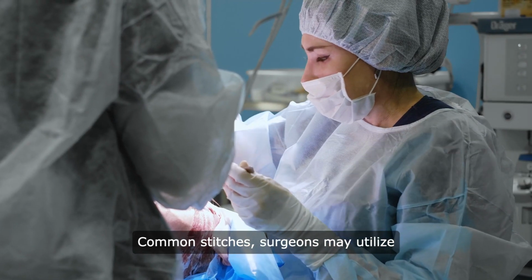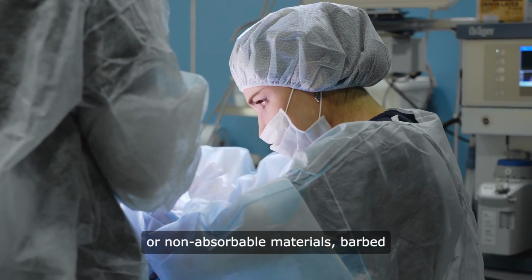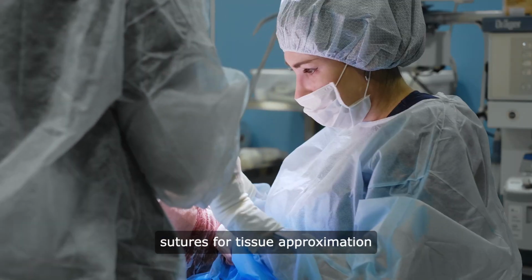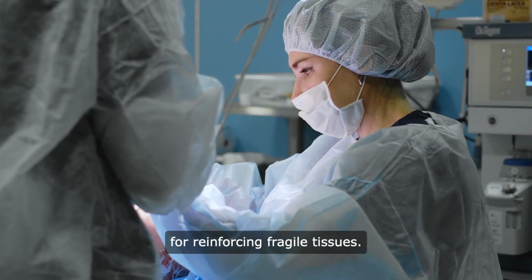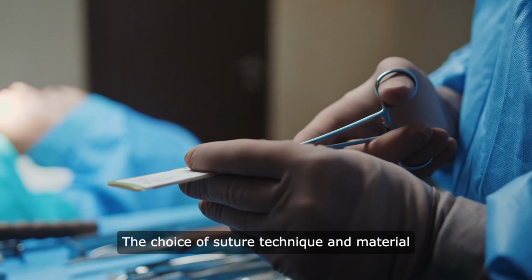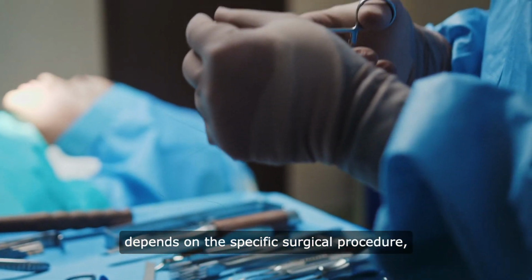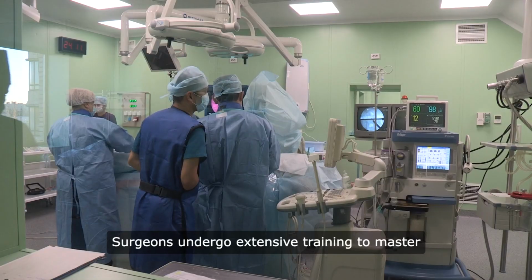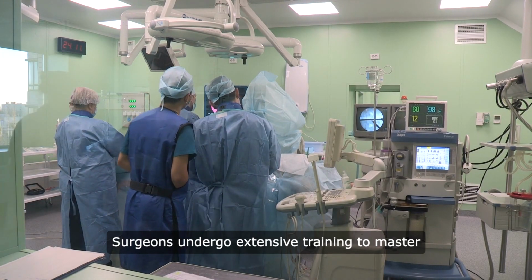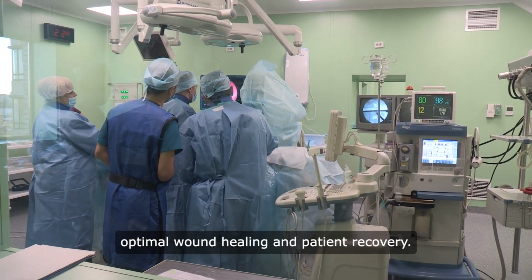Common stitches. Surgeons may utilize specialized sutures such as absorbable or non-absorbable materials, barbed sutures for tissue approximation without knots, and pledgeted sutures for reinforcing fragile tissues. The choice of suture technique and material depends on the specific surgical procedure, patient factors, and desired outcomes. Surgeons undergo extensive training to master various suturing techniques and ensure optimal wound healing and patient recovery.